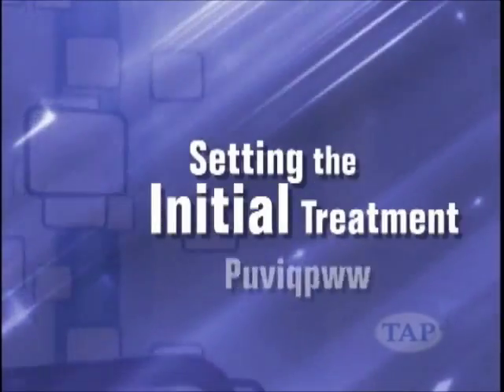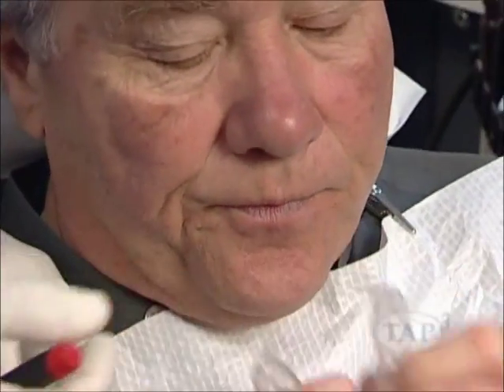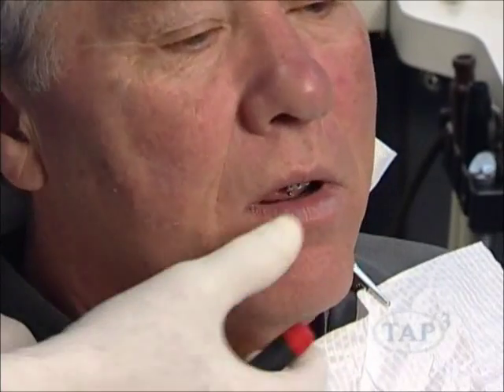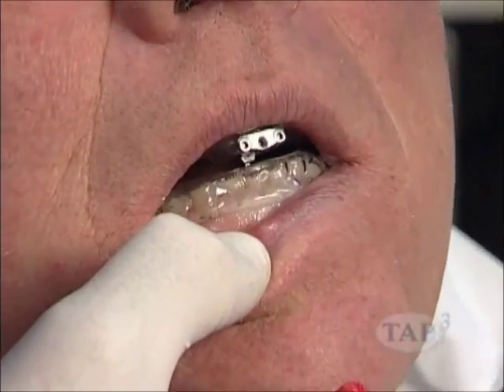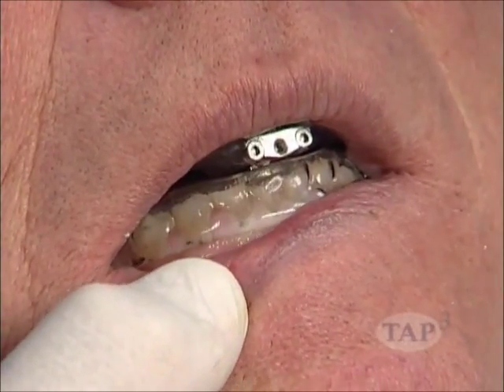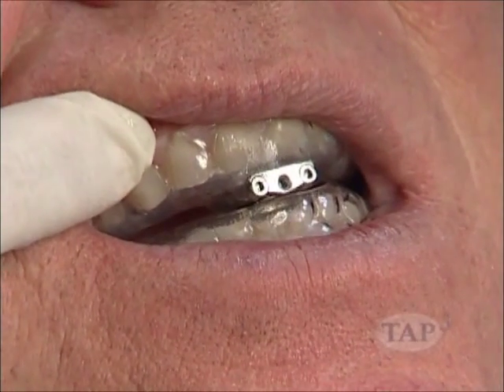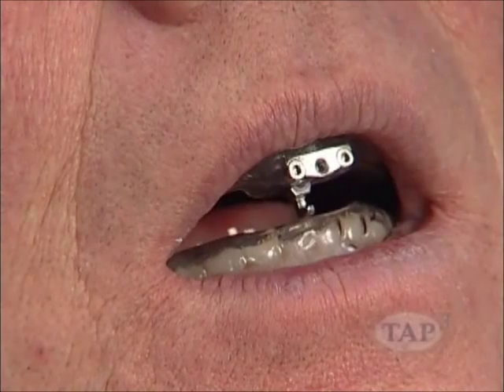Setting the initial treatment position. Have the patient place the upper and lower trays in their mouth. Train the patient to hook the trays together and unhook them. You may have to guide them until they become accustomed to hooking the trays together. Be sure to warn the patient not to bite down on the hook or socket, which could damage the hardware.